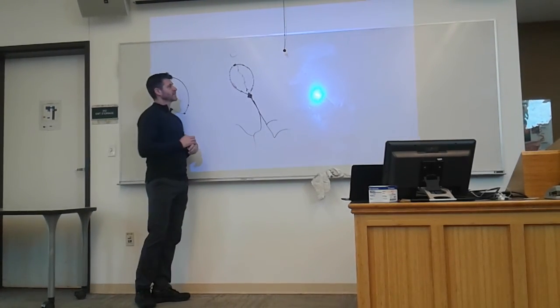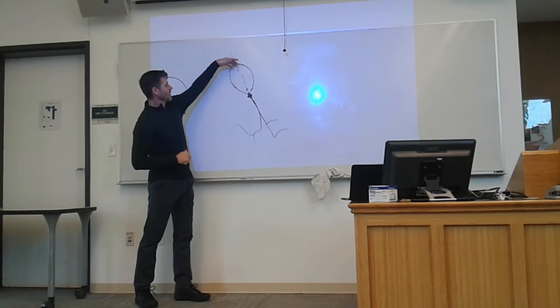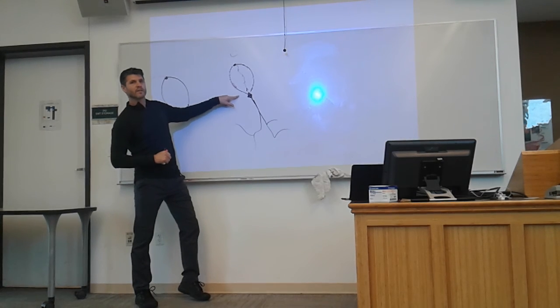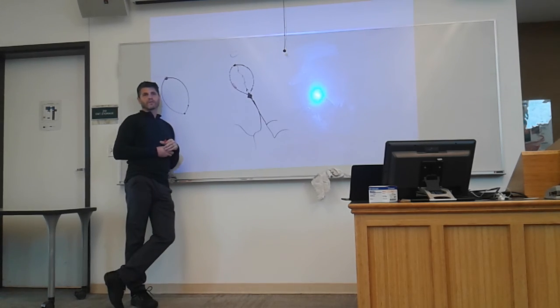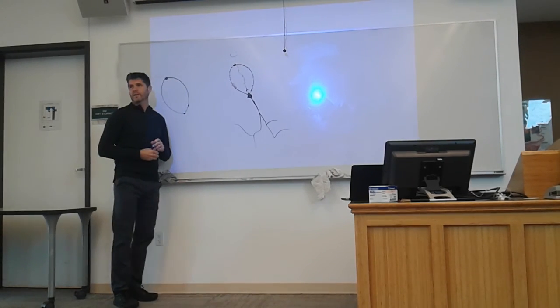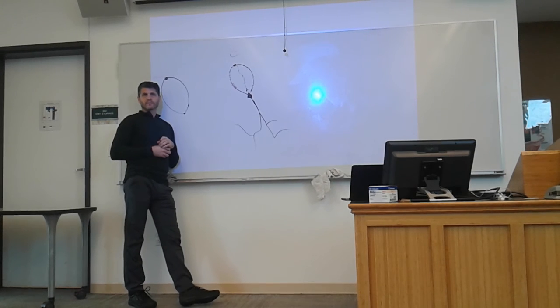So what Mark is suggesting is the circumstances are such that when the signal comes down here, it does come back up this direction, right? And it does hit this area. One of a couple things could happen. What could happen? It would cancel. Signal could die. That's right. The signal could just have canceled itself out completely, right? That's one thing that could happen, potentially.